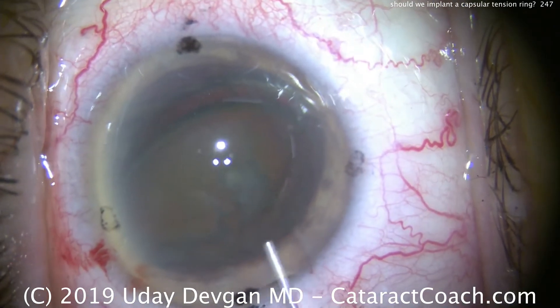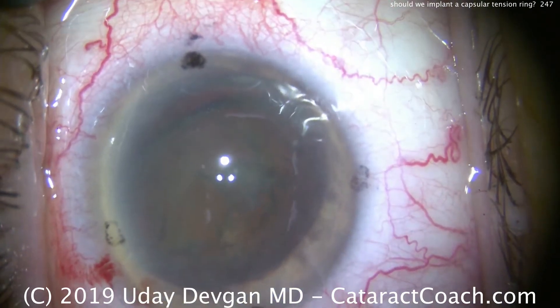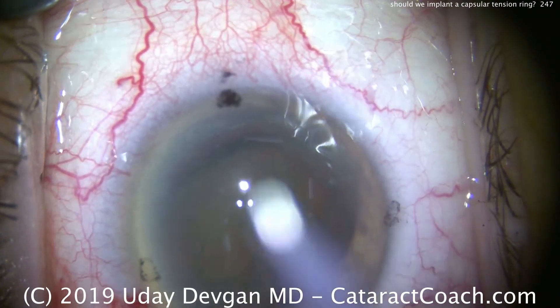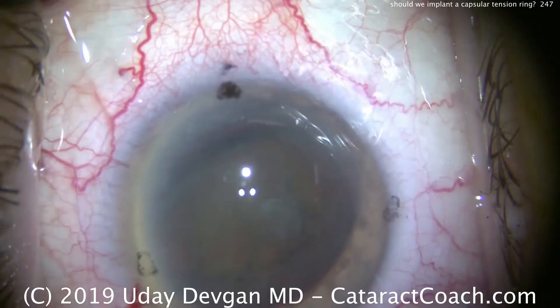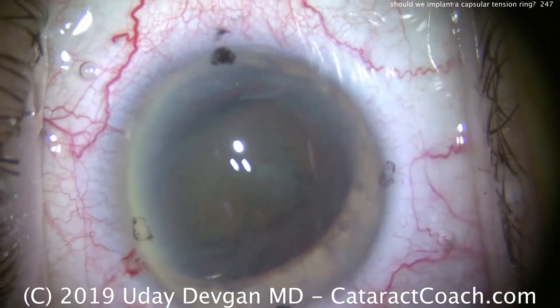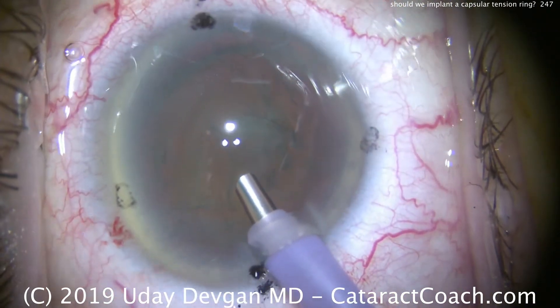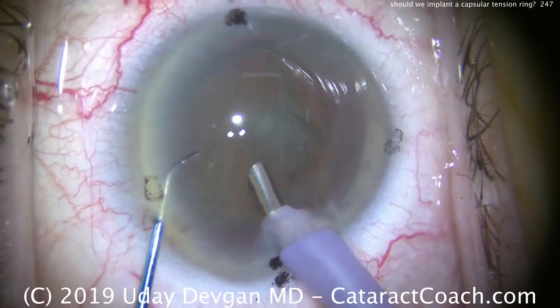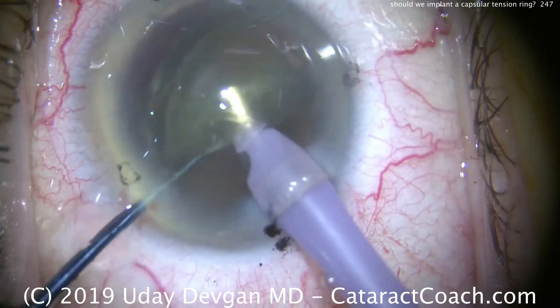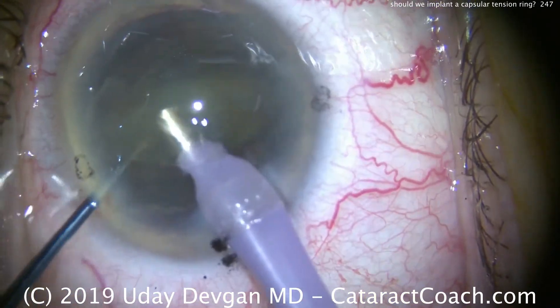Injecting more dispersive viscoelastic to protect the cornea, we'll put our phaco probe in the eye and do a variant of phaco chop. I do like this lens tilted out of the capsular bag — I think there's much less stress on the capsule and on the zonules compared to doing a divide-and-conquer technique or even a chop in the bag. There's our first chop; we have two halves. Each hemi-nucleus can then be emulsified.